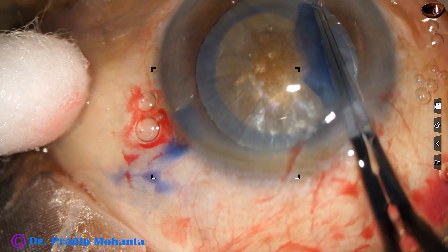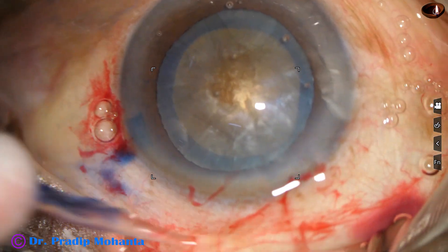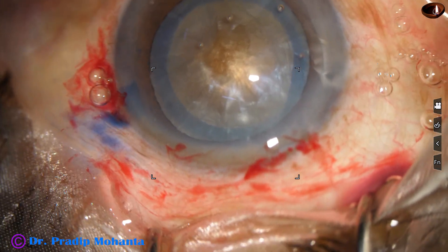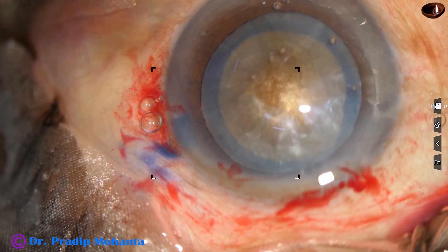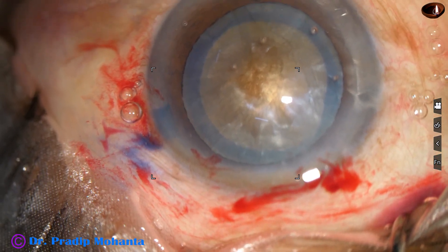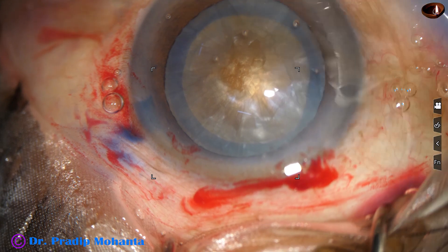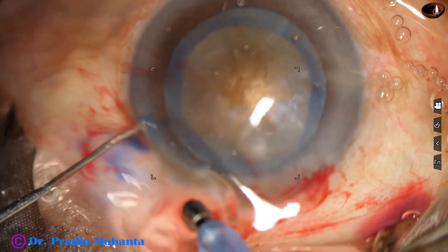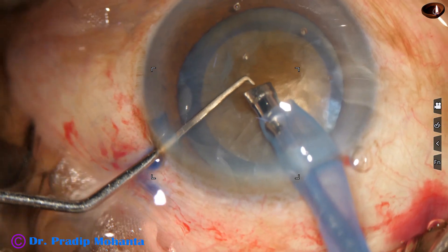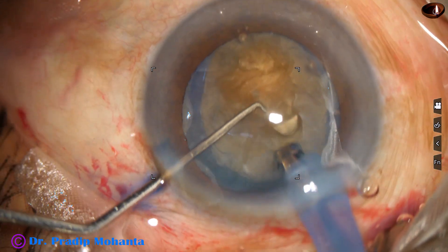In hard cataracts, we must not do a rhexis smaller than 5.5 mm in diameter. So the size of this rhexis is about 5.75 mm, which is adequate. If we do a small rhexis in hard cataracts, we cause a lot of zonular stress, and management of the large hard fragments becomes difficult. So always do a rhexis larger than 5.5 mm — even 6 mm — in hard cataracts.